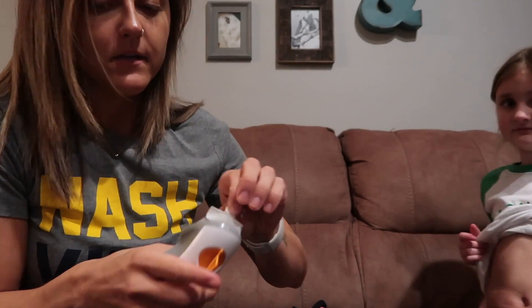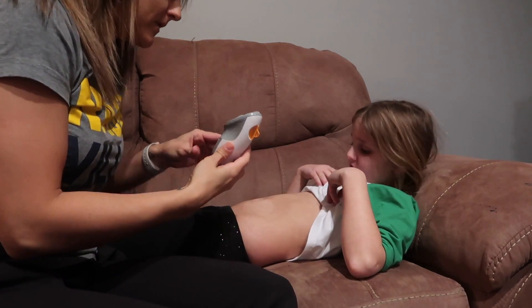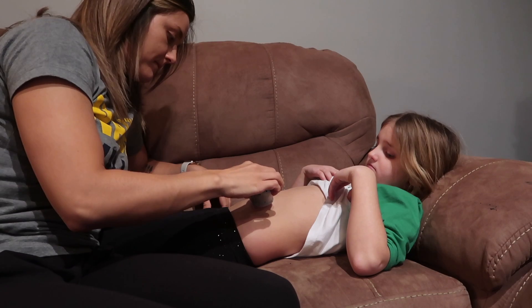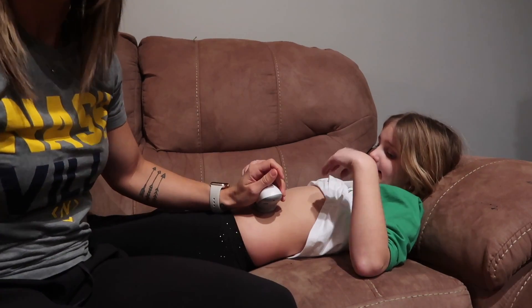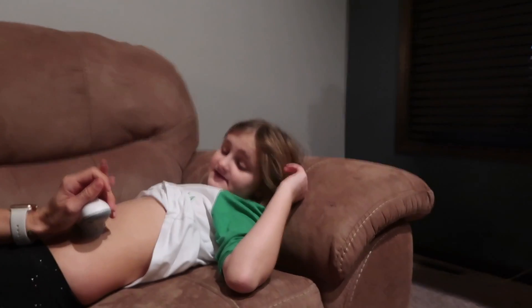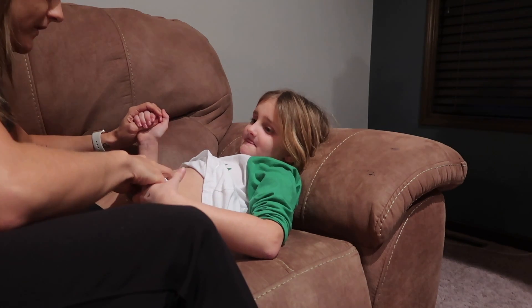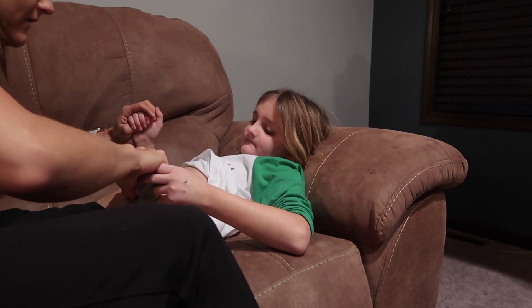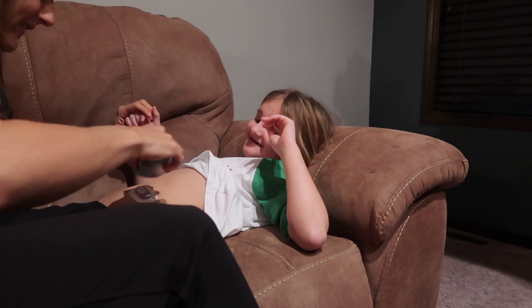5-9-3-7. Here we go. Can you count to 10? I'm going to see where you're going to put it. Ready? Because I don't like when I count — I'm going to stop it. 1, 2, 3, 4, 5, 6, 7, 8, 9, 10. No hurt! No hurt! That was fast!